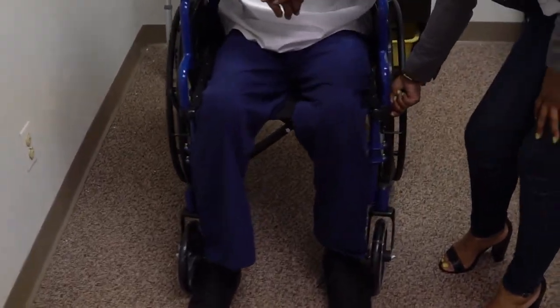Hey, Mr. Bailey. One of the things you want to make sure you do before he gets up from the wheelchair to even get the weight is you want to make sure the wheels are locked. So we're providing safety. I'm going to lock your wheelchair.